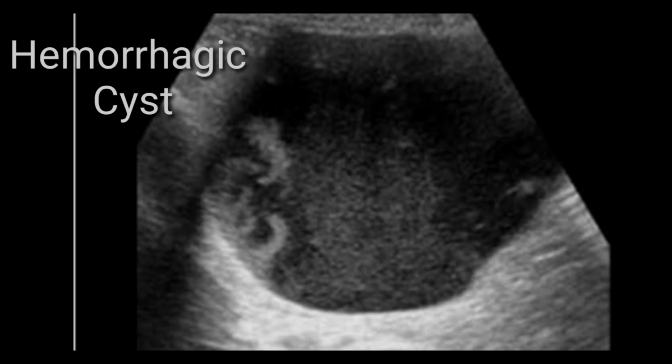You can see low level internal echoes floating within the lumen of the cyst. Beside this, you can also see some thick septa or debris. So far as the wall is concerned, the wall is not thick. Slightly thickened particles and debris can be seen within it, which could likely be fibrinous tissues. So this explains a hemorrhagic cyst.